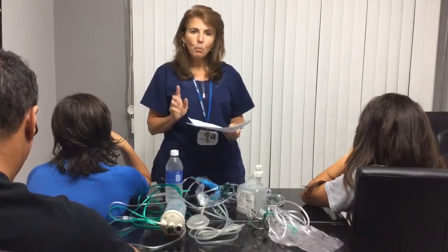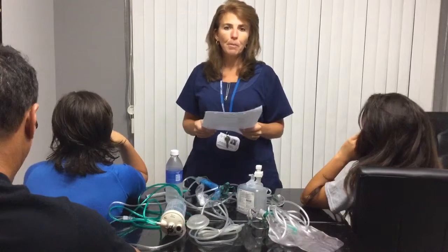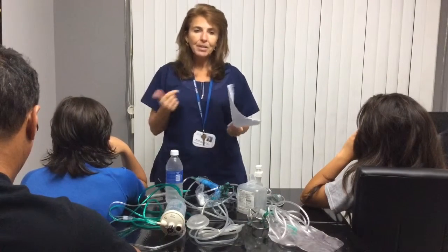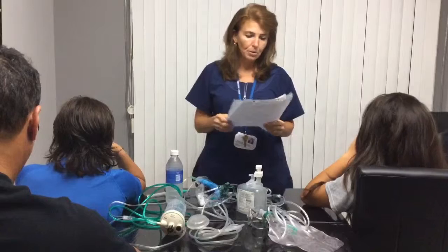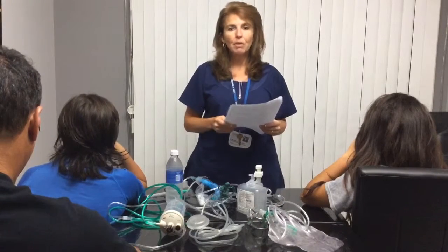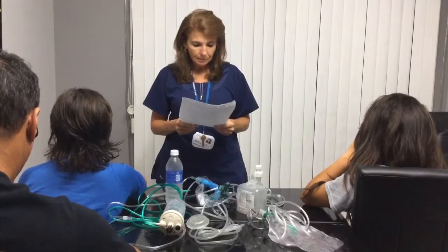And one of the other things that I had, there's a good safety tip from the American Lung Association, and that's actually no Vaseline products, anything petroleum-based, because they are also combustible. So therefore, you do not want to have your patients using those types of products. If anything, it should be water-based.